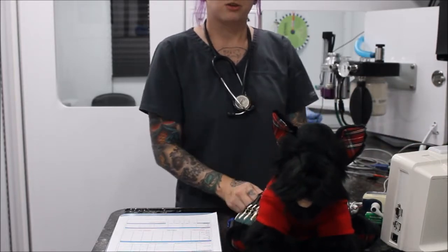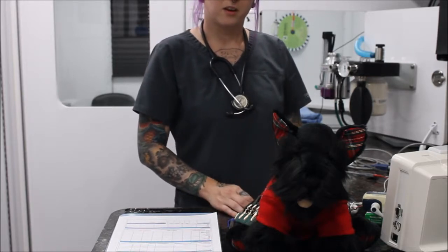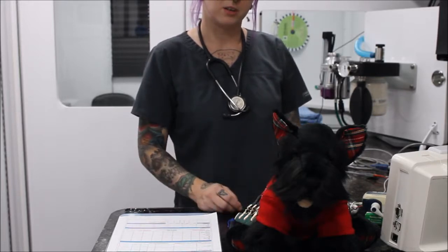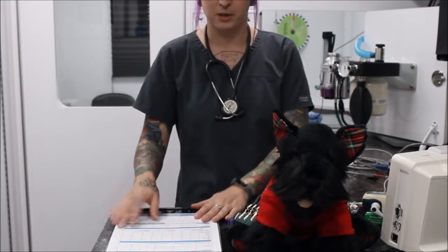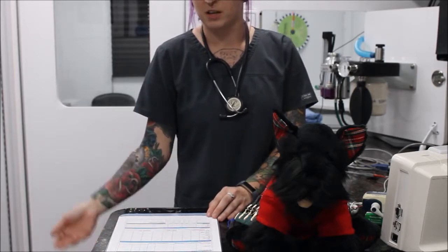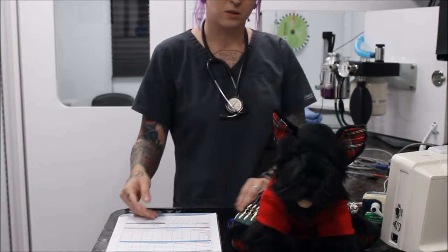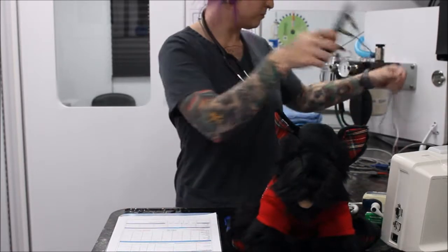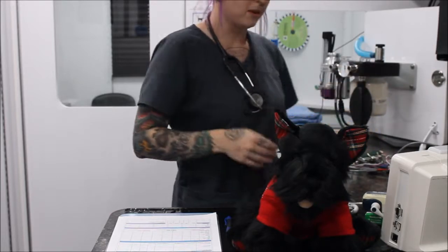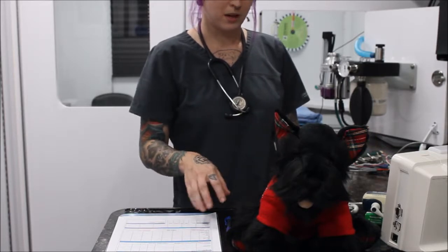Sometimes certain drugs and medications could increase the heart rate and make the rhythm uneven too. So that's again where we make sure we look at our patient's chart and ask beforehand if the patient is on any medications, or the type of anesthetic drug we've used as well can cause them to have some abnormalities show up on the monitoring system. But again, that's why we do listen, just to confirm that everything does sound and look okay.